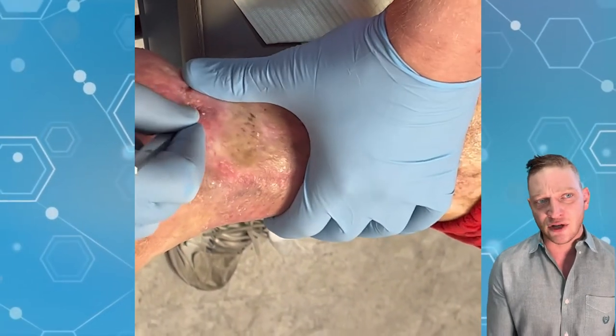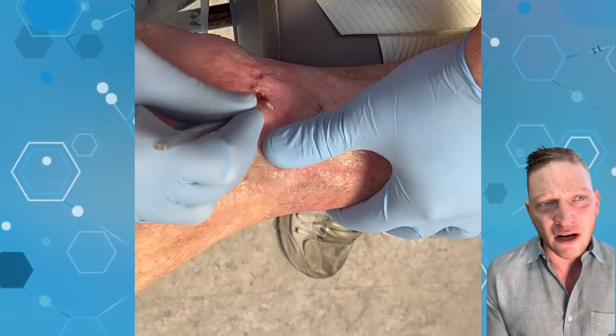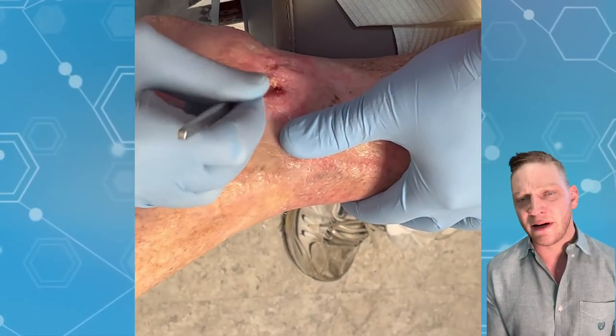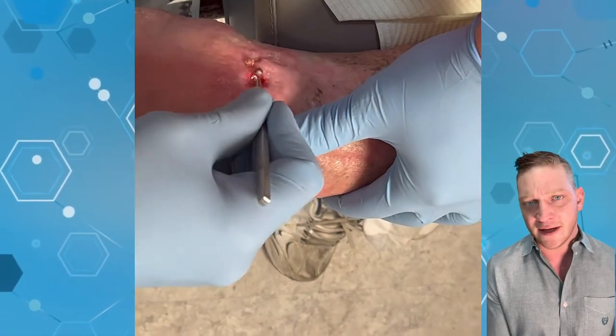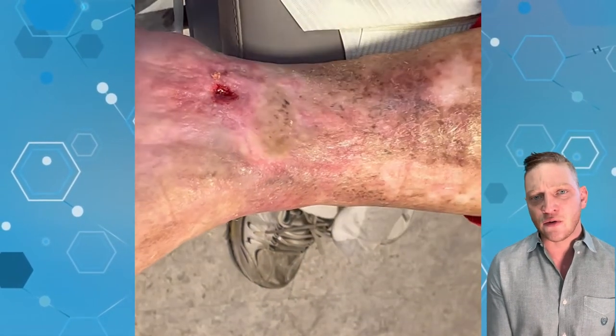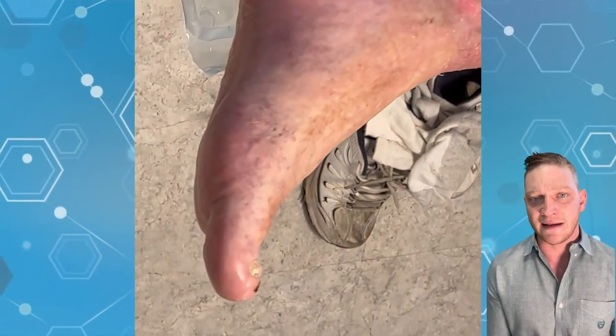You can see the debridement: I take the measurements, I clean it up, I put the curette to it. It's measuring about one centimeter by one centimeter. You can see that yellow slough material on the inside of it — that's called fibrous tissue, or fibrotic tissue. It is not granular tissue.